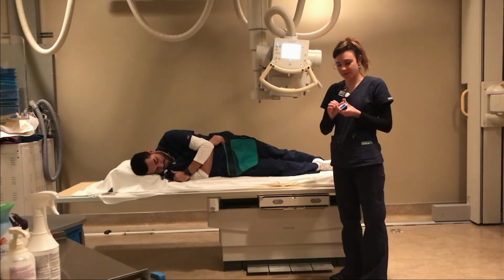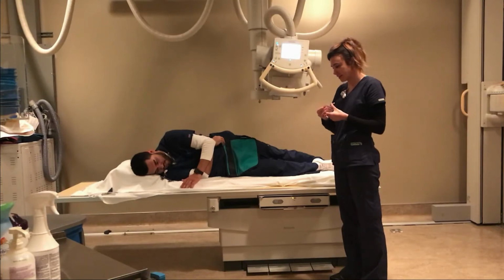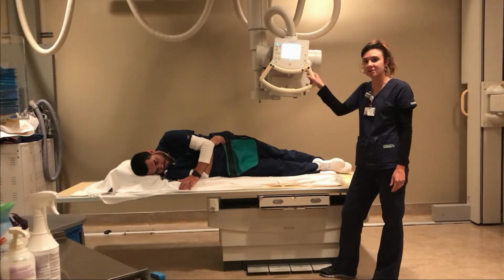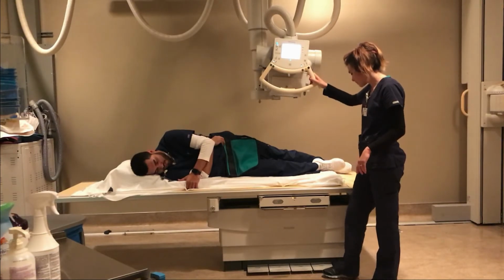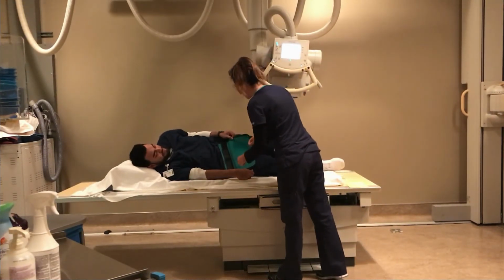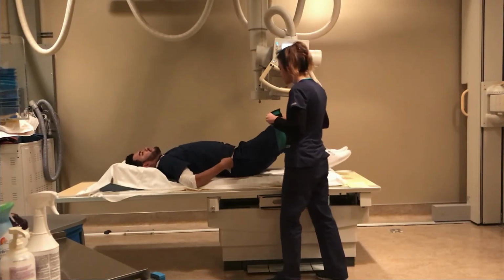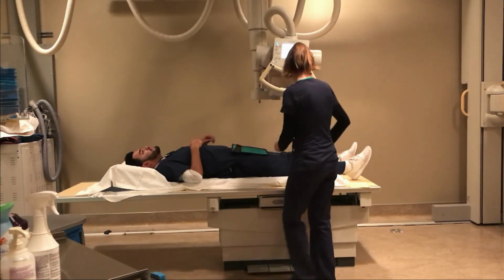So like I said, for those projections, according to Merrill, for manual technique not using AEC, for a normal adult, we would be using 85 kVp at 2.5 mAs for DR. So let's set up for the next ones. I'm gonna go ahead and just, you can go ahead and roll back onto your back, Phil. Alright. Just gonna put the shield back on you.